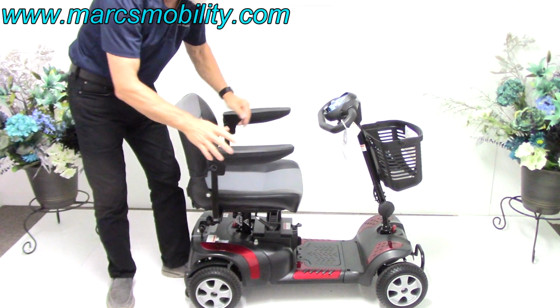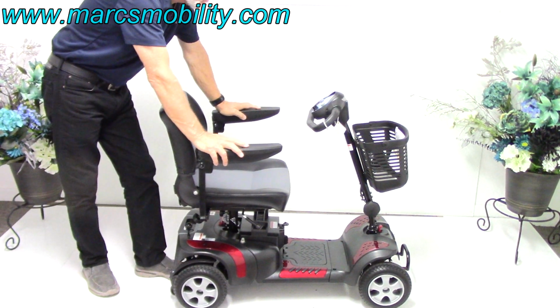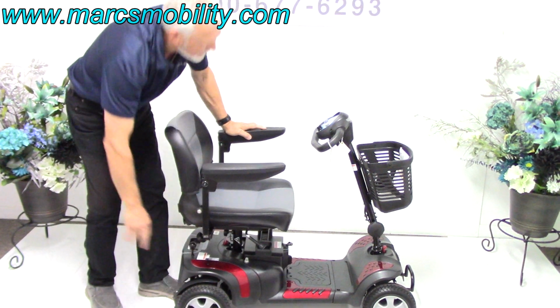We get so many phone calls. My scooter's not working. What did you do last night? We pushed it into the house. Well, you have to put it back in gear after you push it.